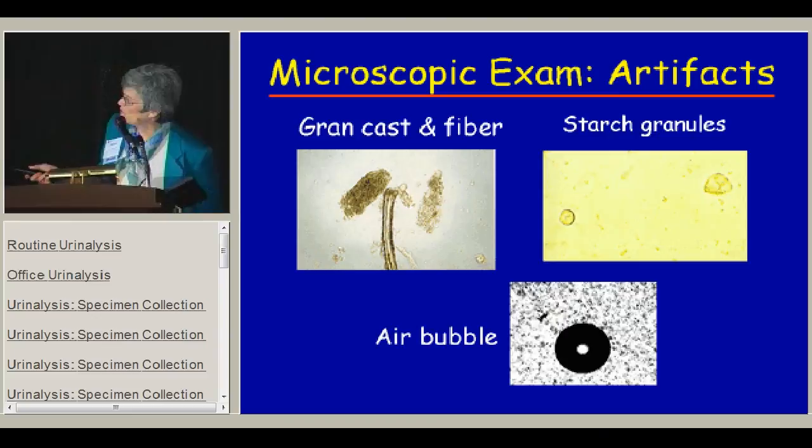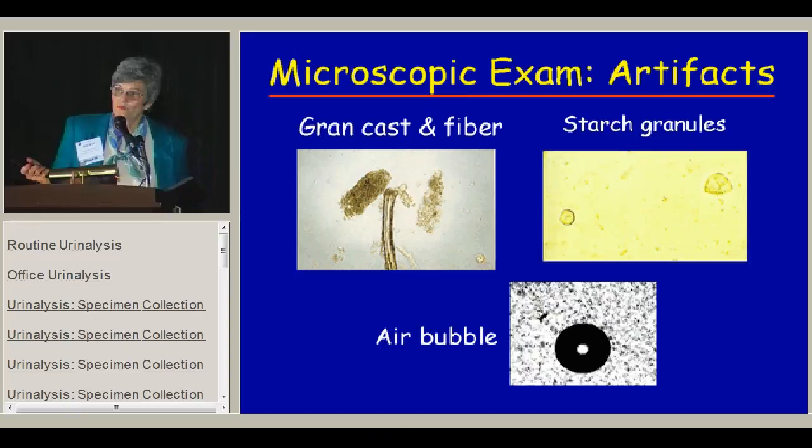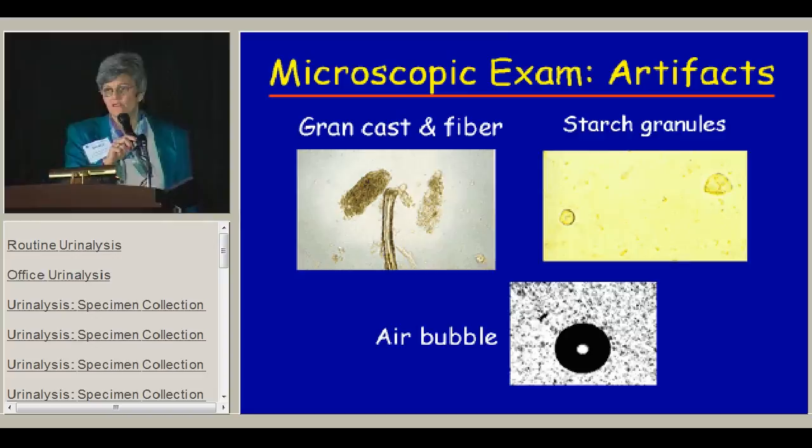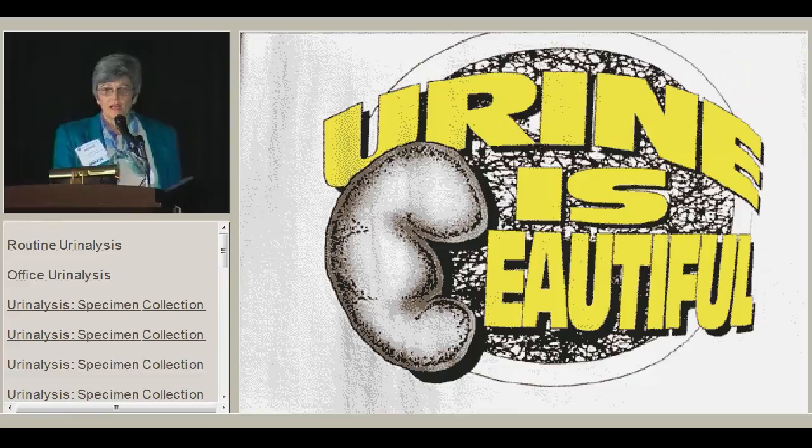Finally, we see lots of artifacts in the urine. The most common is fiber from gauze used to have patients clean off — if you don't know, you might want to call that a cast, but a granular cast looks totally different from this fiber. Starch crystals used to be seen when people used cornstarch for babies' diapers; we see mostly talcum powder now. You can also be confused by an air bubble in the urine, which makes you think you have some crystal, but it really is nothing.